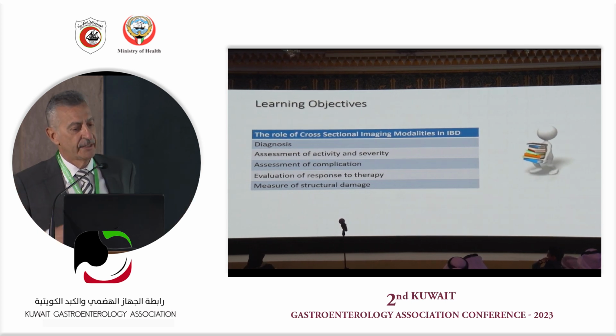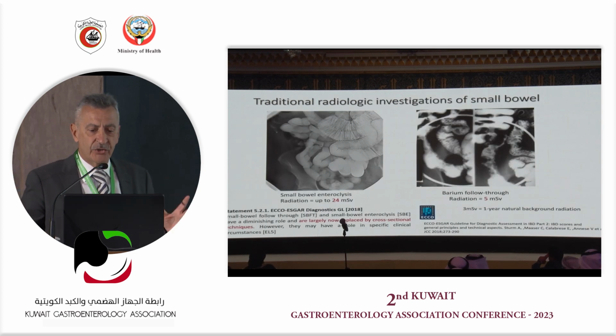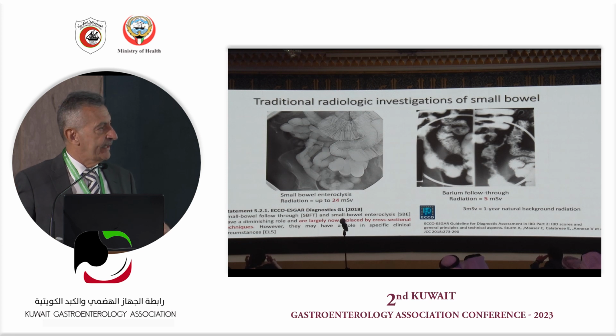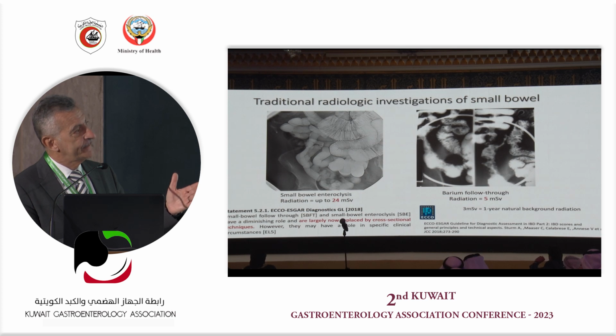assessment of complication, evaluation of response to therapy, and measure of structural damage. So don't forget the traditional investigation, but use them very cautiously, because although they eventually have some role in a few patients, they are for sure outweighed now by the beauty, the efficacy and the accuracy of the other imaging I will talk about. And also don't forget about the radiation exposure.